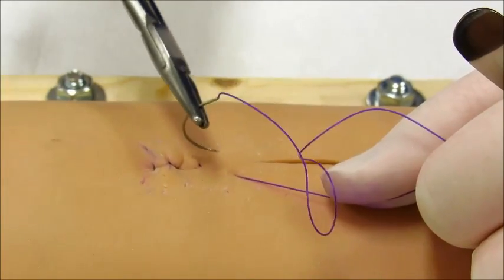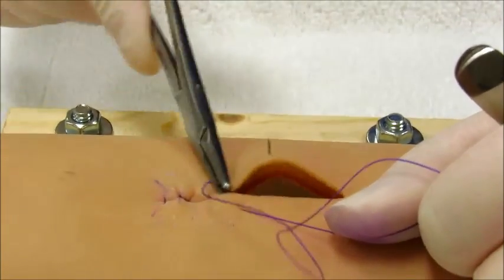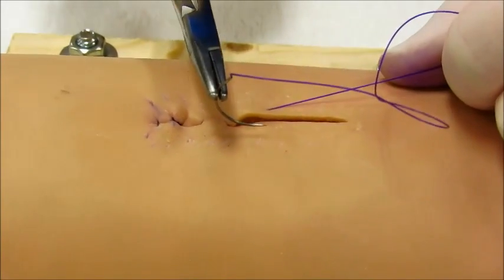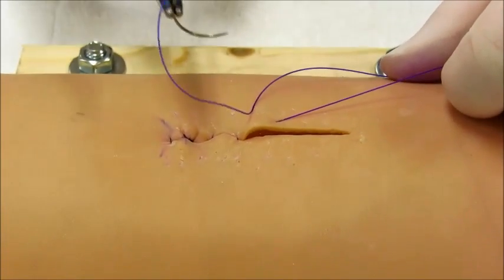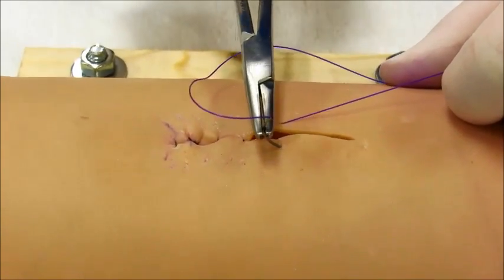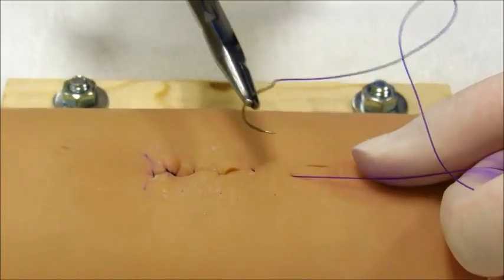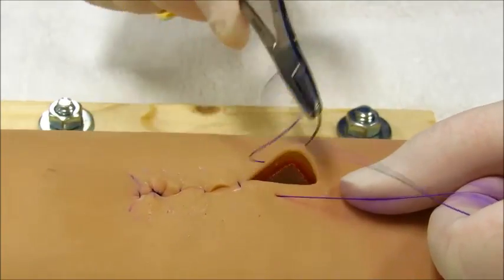The distance away depends a little bit on how much lumen reduction you can allow for yourself. So if you're closing something big like the bladder or a uterus, it's not as critical that you get as close to the incision. If you are closing something like the small intestine, where luminal reduction is a real negative thing or something you want to avoid, then you would want to come as close as possible to the incision. In general, though, you always have to be at least 2 to 3 millimeters away in order to invert it properly.